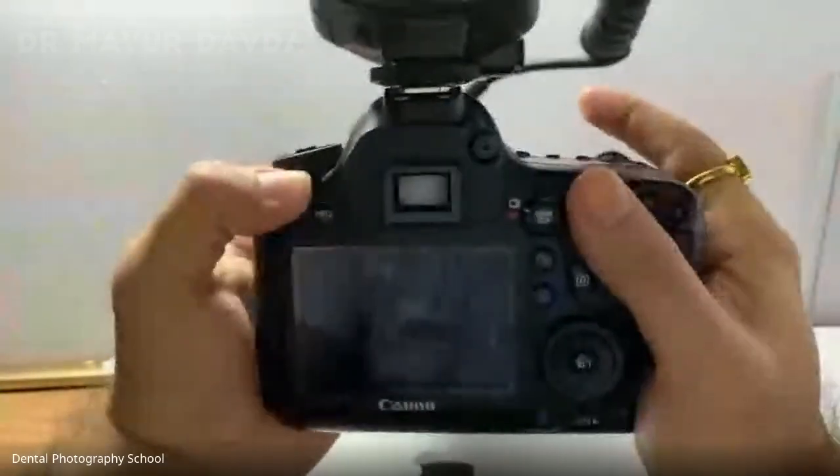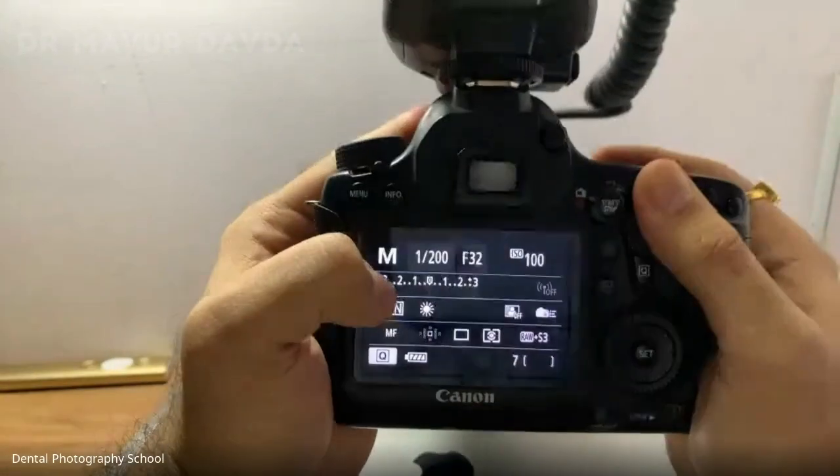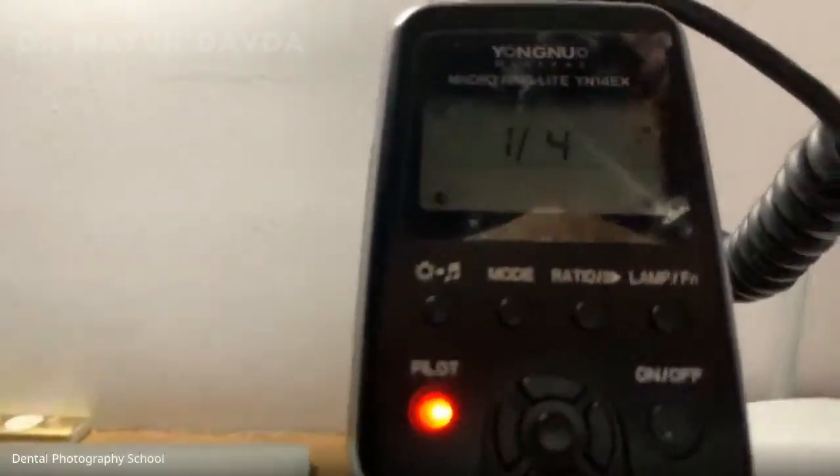All right. So I am ready with my camera equipment. I'll just put it on for all of you, so you can see my camera settings. Now I'll show you my flash settings. So let me just move the laptop slightly. So these are my flash settings.